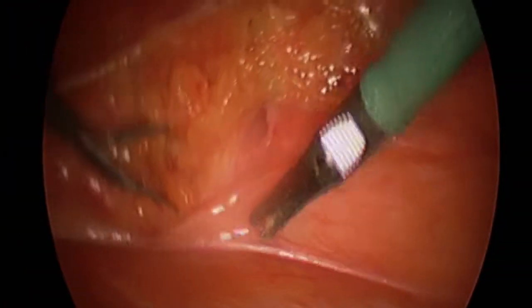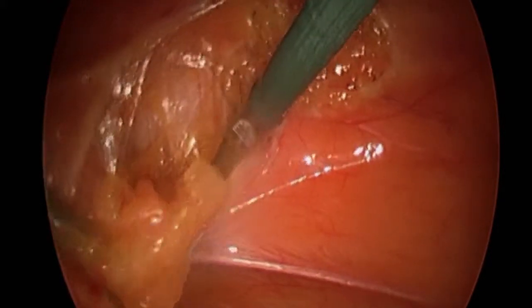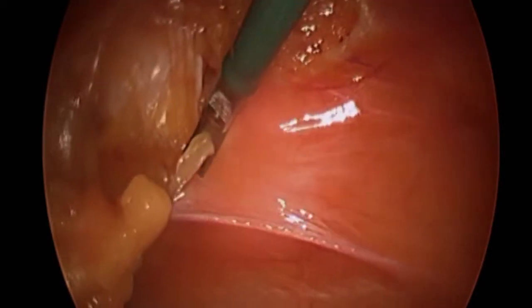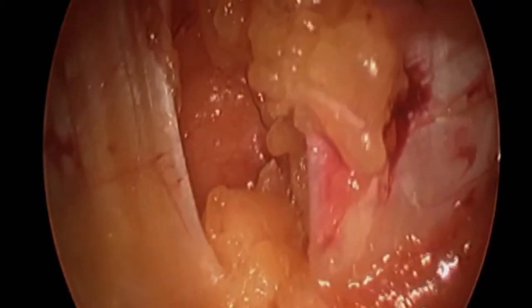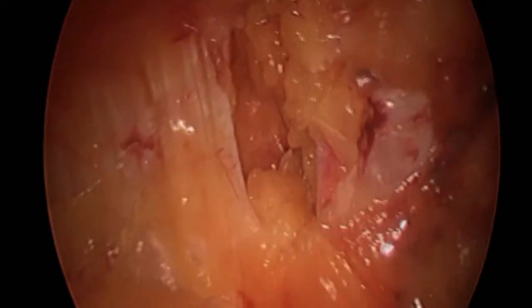We notice that there's fat around the ventral hernia defect and a decision was made to take the fat down. This will allow for better apposition of the fascial edges under direct visualization.